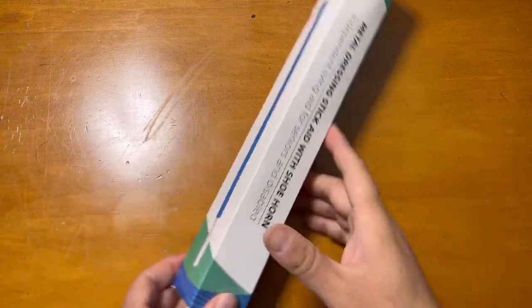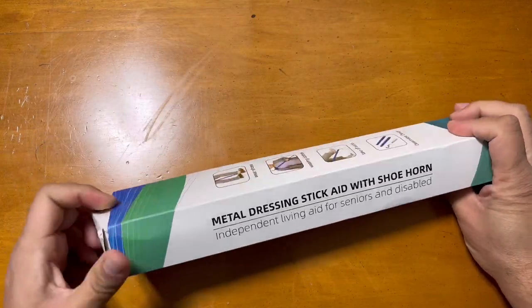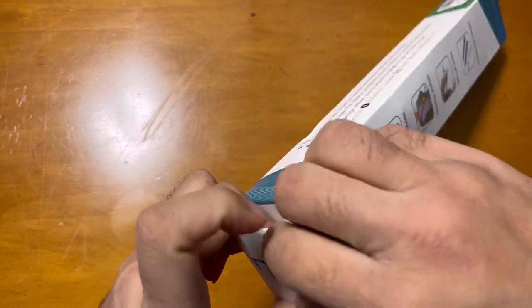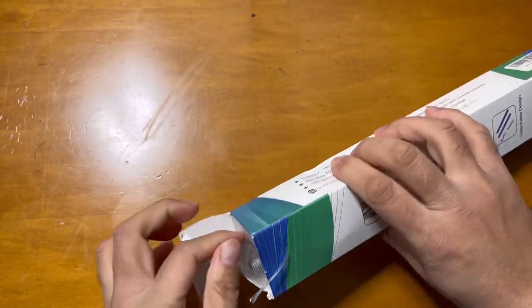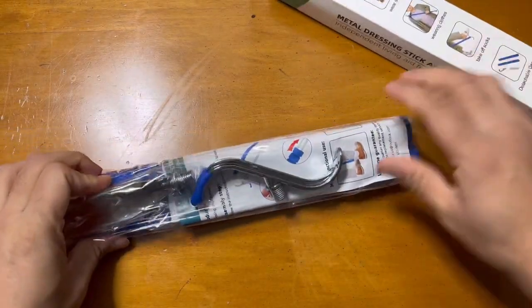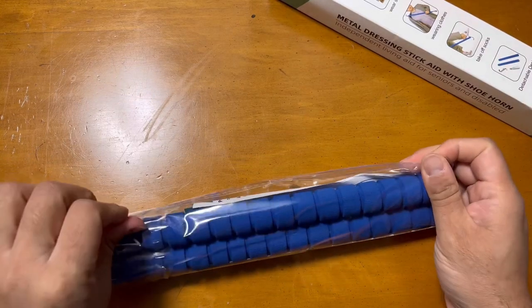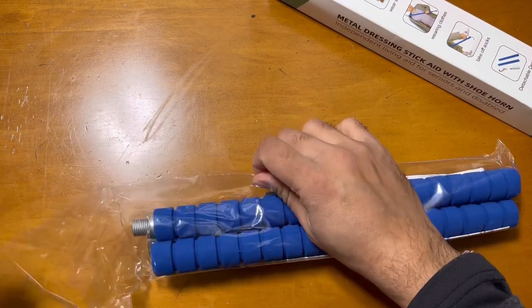Hey guys, I'm showing this shoe helper, the Fenwar - you know, the metal dressing stick and shoe helper thing. You can see it's made of metal and comes with this packaging. You need to assemble it a bit.